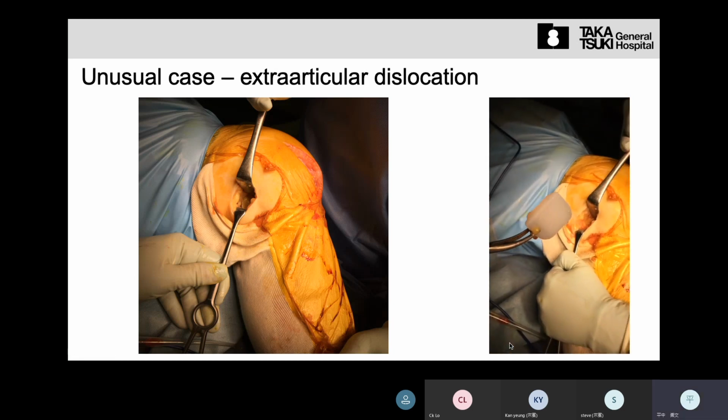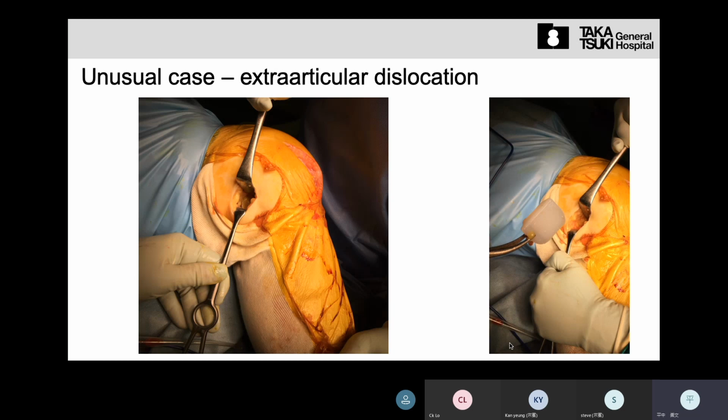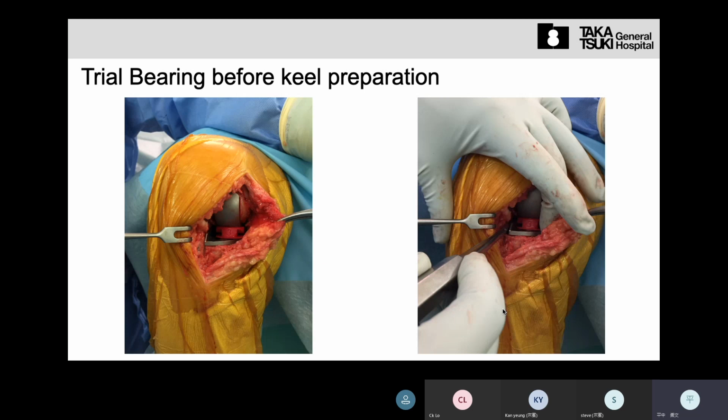This patient had maybe two or three dislocations. So this bearing is a 6. Even using the 6 bearing, this patient dislocated posteriorly and outside of the joint into the muscle. So sometimes separation of the bearing can occur. So I recommend checking the relationship between the tibia tray and bearing before the keel preparation.